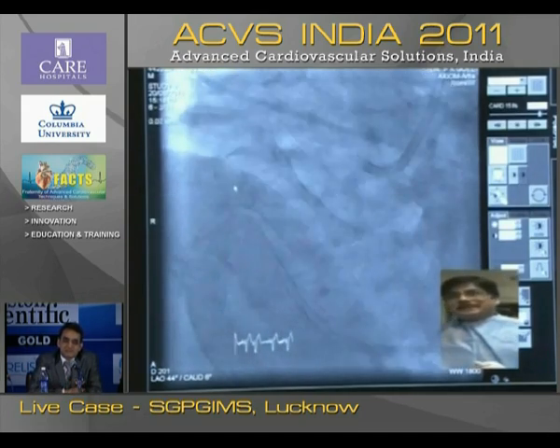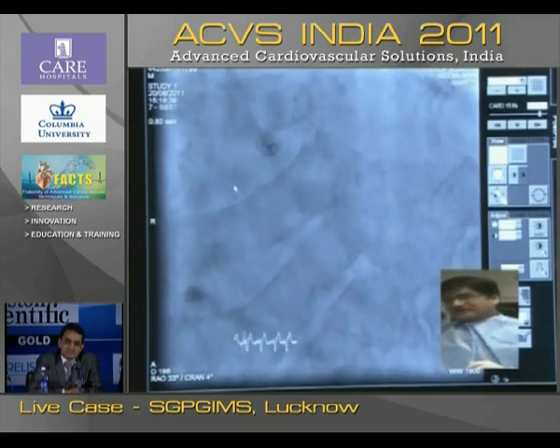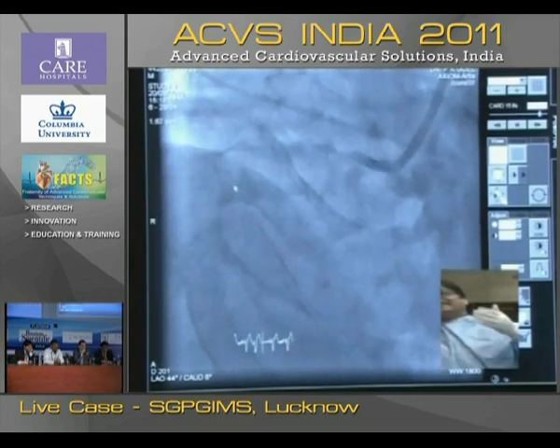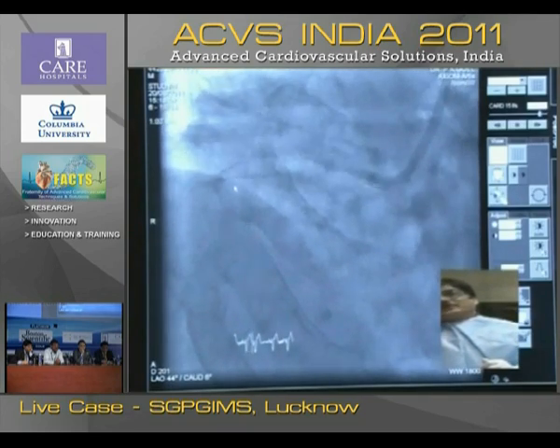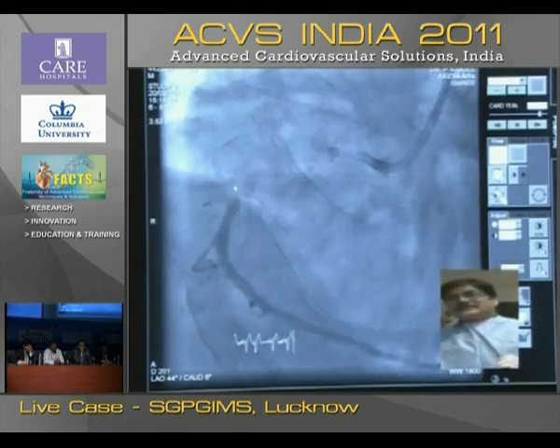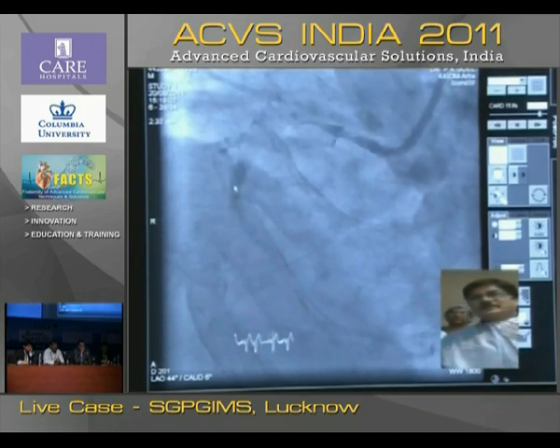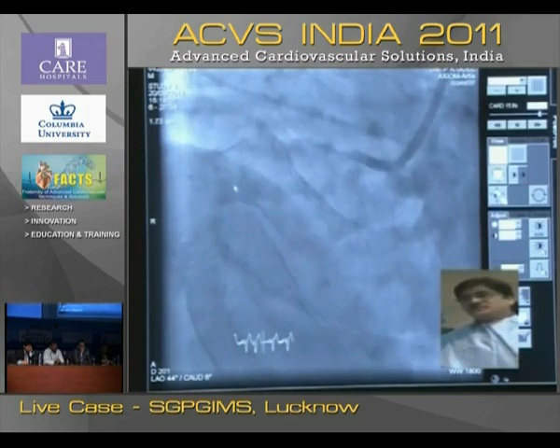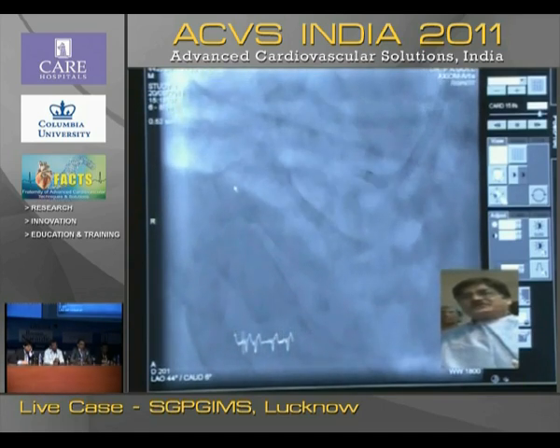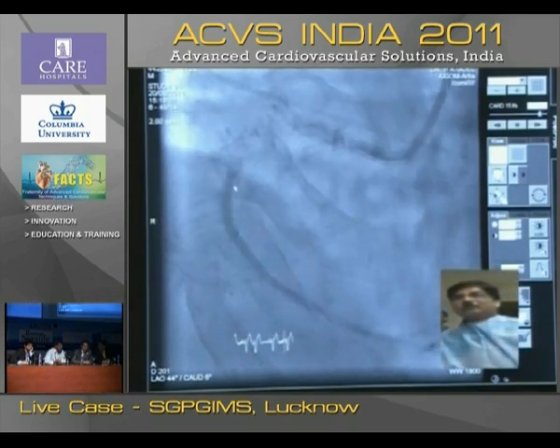So, this lesion incidentally has some good parts in it. There are very heavy bridging collaterals. Yep. The bridging collaterals tell me one thing, that it is really chronic. But the only good thing is I don't have to do a counter injection, because it is filling through the collaterals antegradely. So one puncture is doing my job. Otherwise, I would have had to do an opposite side puncture to look for the distal vessel, because that is what my landmark would be for crossing the lesion and putting the wire in. So if you want any other suggestions, or should I go ahead with the case now?